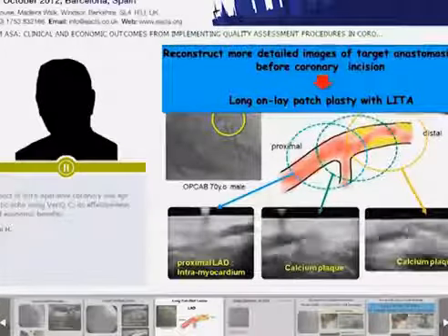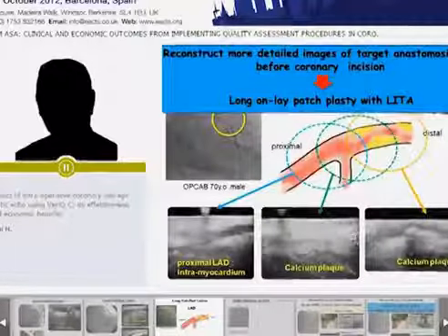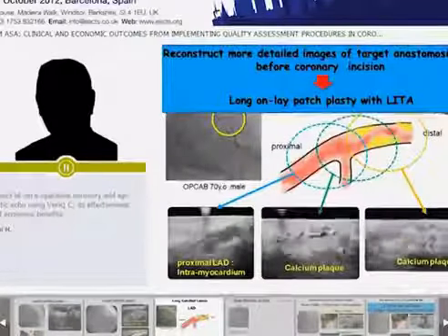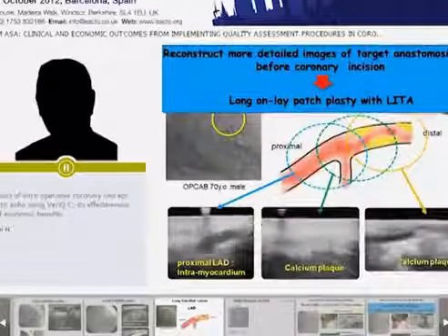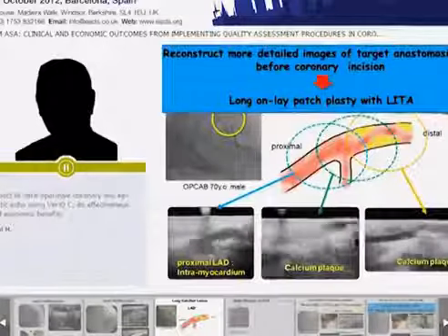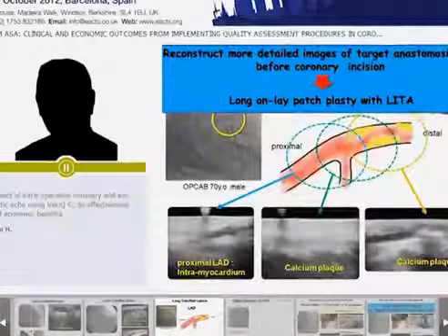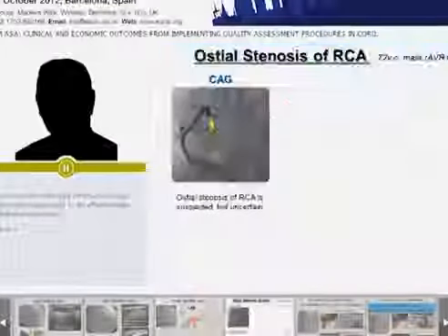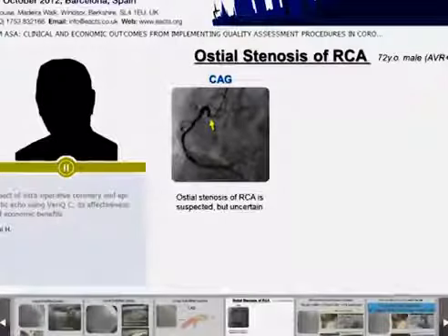Like for mitral valvuloplasty, where you scan the mitral valve and make images of it before you start repair, before starting the incision of the coronary artery we make this kind of picture. Then we get an adequate anastomosis. In this case, I made a long onlay patchplasty.